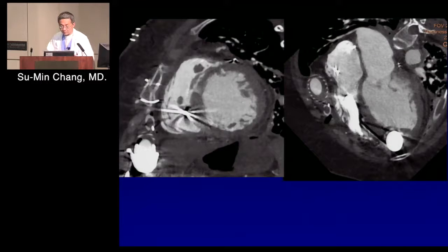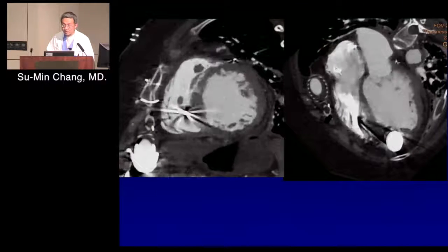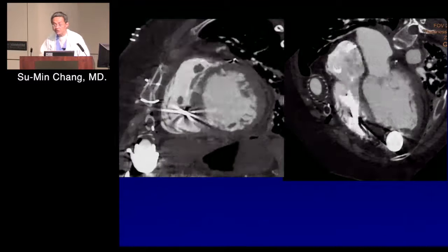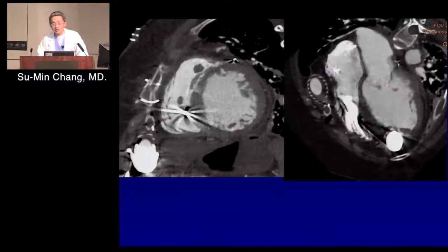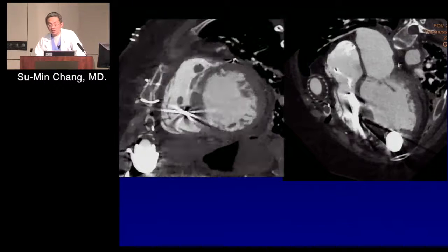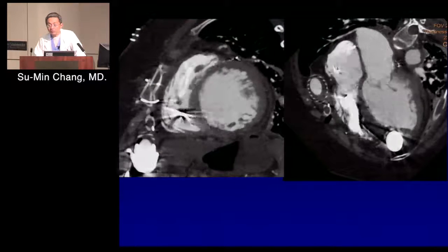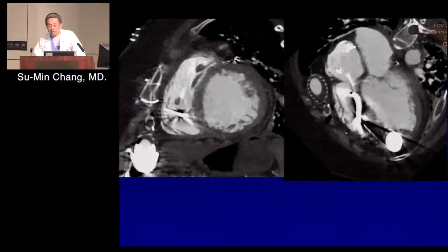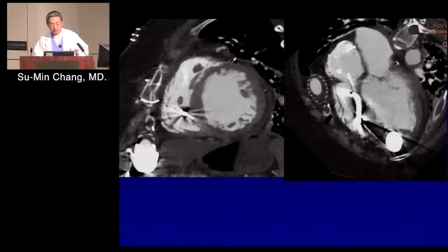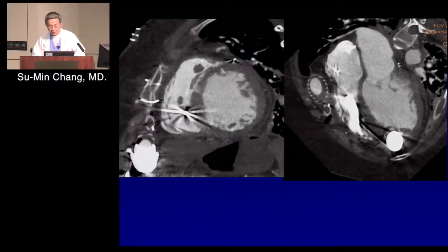And if you want to come over here, look at the screen. So this is the other potential utilization of CT. In the old days with the old scanner, the amount of radiation would be, I wouldn't say prohibitive, but you wouldn't be able to do this often. With our new scanner, we have the power, we can do lower kV imaging. And now we try some different protocols to reduce the amount of contrast we use. So that makes this a potential alternative to echo or even TEE in patients where you really have a hard time assessing RV function.